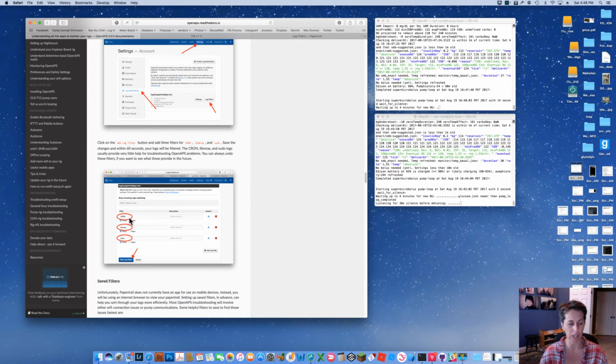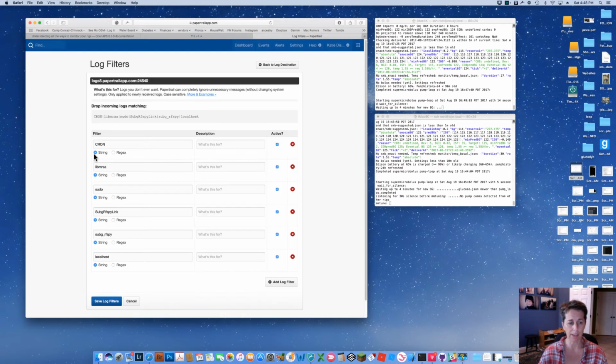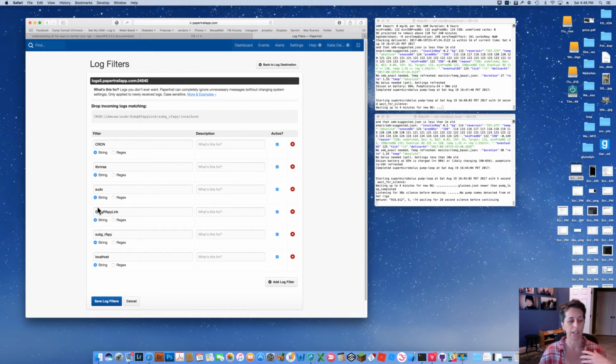The three that I recommend are cron, libmraa, if it has a pronunciation, it's beyond me, and sudo. Mostly because those ones really don't add to your troubleshooting or information, and they spit out a whole lot of lines of information that you really don't need counting against your data cap. So I have those three blocked. I also really don't like my localhost flow, so I have those blocked because I just don't want to bother with them. You don't have to do that. You don't have to do any of these, but it makes the view of your logs coming in a little bit cleaner. So you can add all of those and save them.